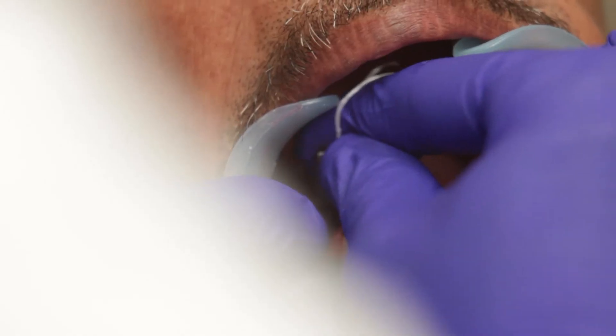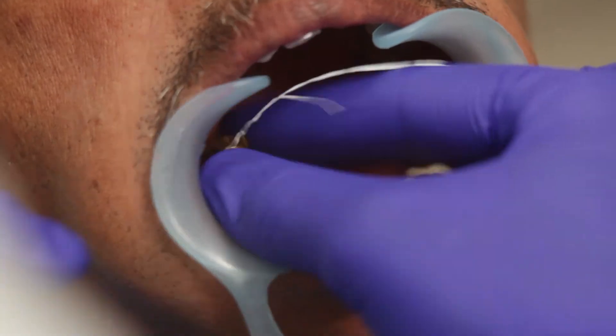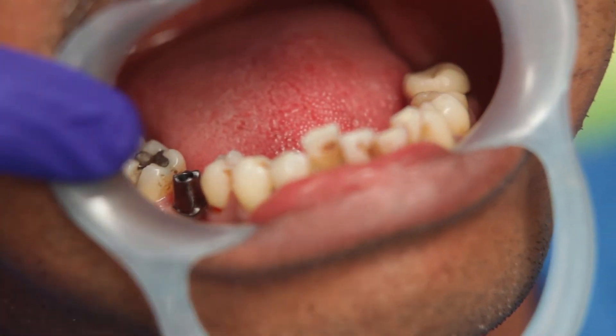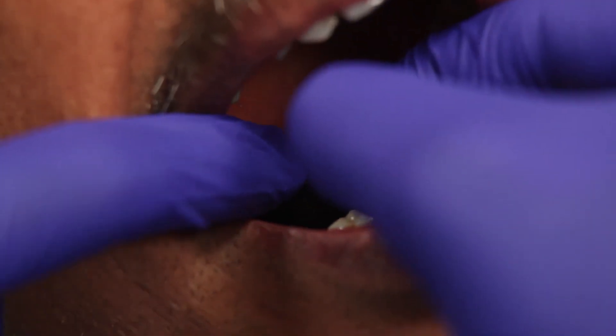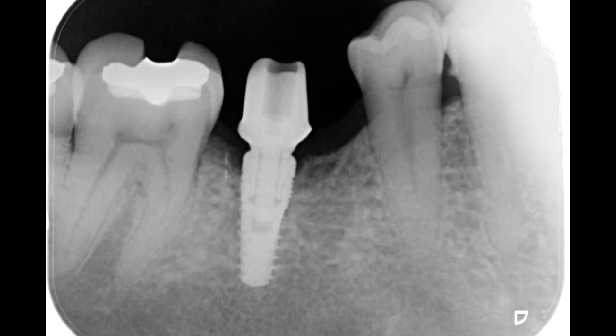Once I have placed it, I will tighten the screw again and take off the jig. I can take an IOP at this stage to evaluate complete seating of the abutment. So the abutment has now been transferred to the patient's mouth accurately.